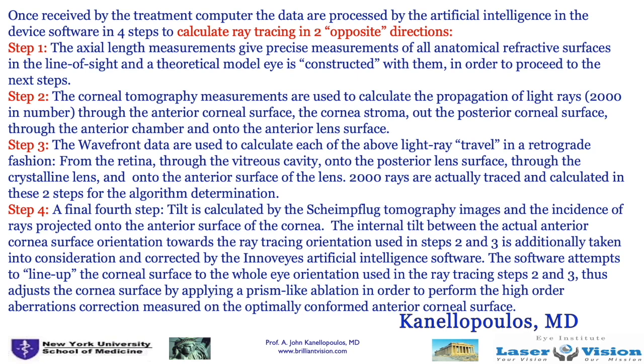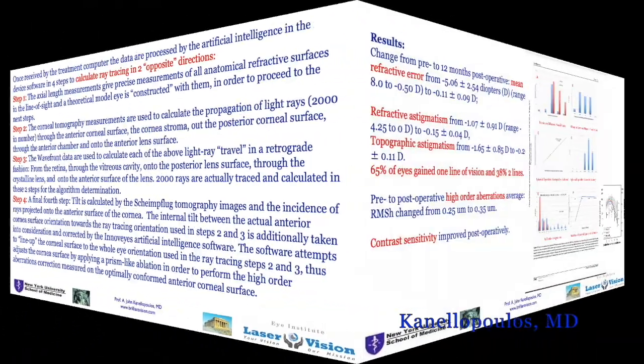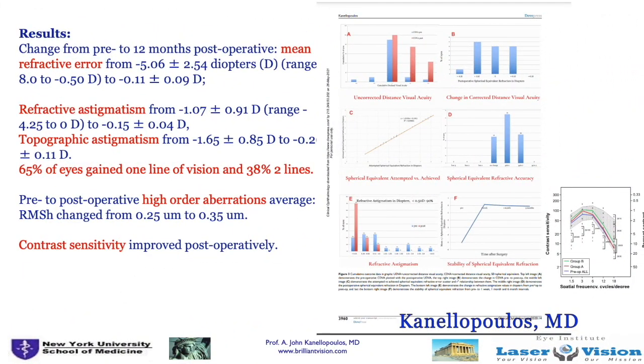And these data are then coordinated to create high order and low order aberrations. So in low order, the amount of myopia and astigmatism; in high order aberrations, mainly coma and trefoil; and also the tilt between the cornea refractive surface and the lenticular refractive surface. This is a key element to the concept, and thus it is able to provide very detailed data for aberrations.